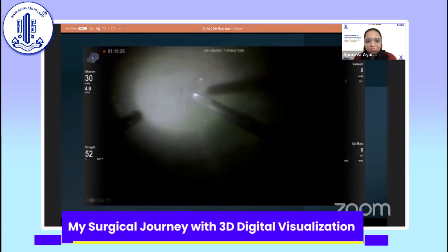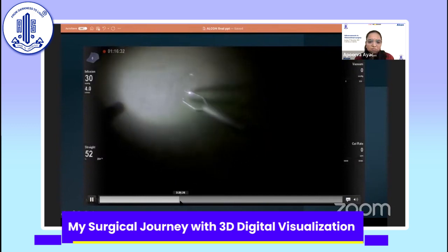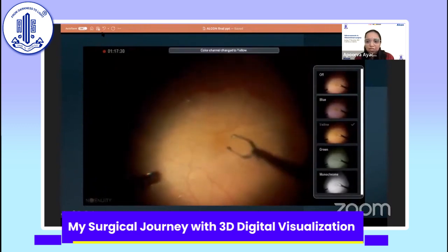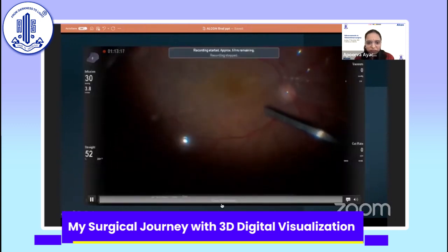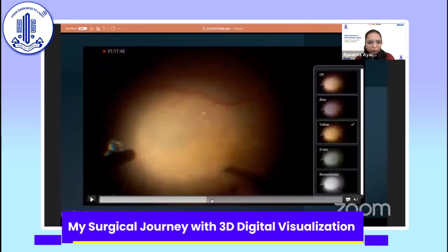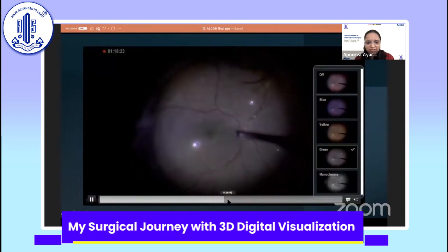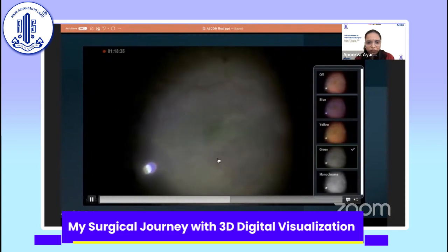I was not really happy with the green. So these are the various filters. Then I came to these actual thumbnail previews of the filters. So I used yellow first, wasn't very happy. Then I used green. It wasn't very clear. I stained again. After staining, yes, it was much better visible. Contrast was much better.